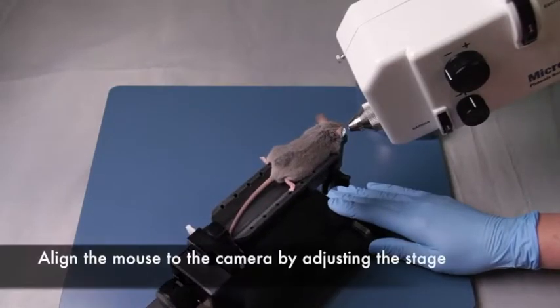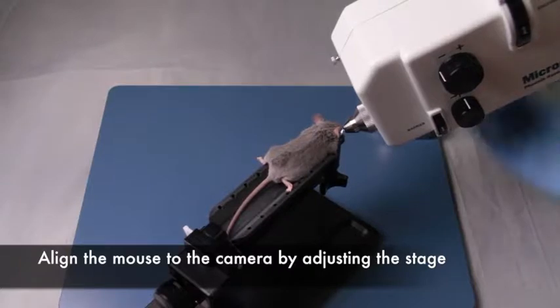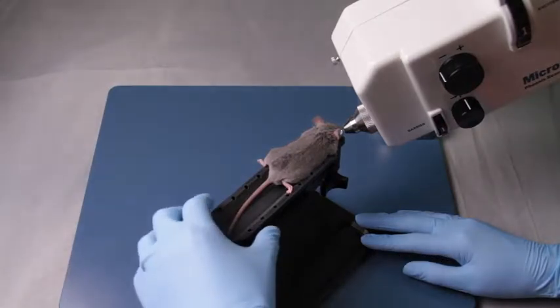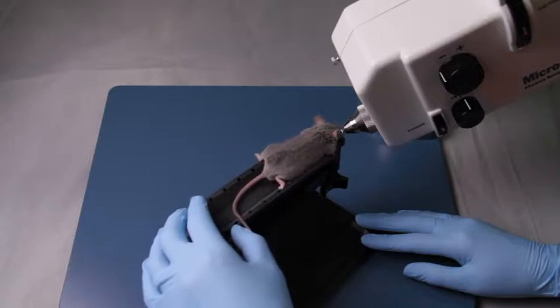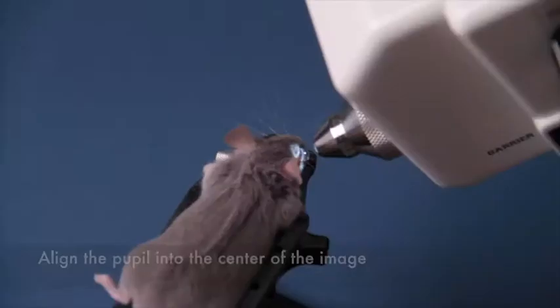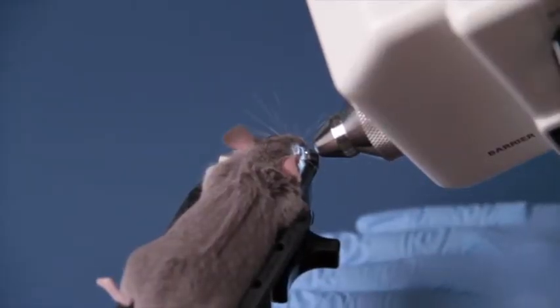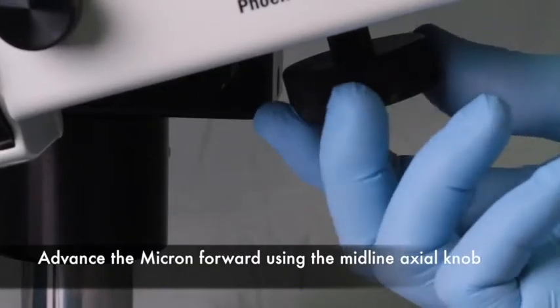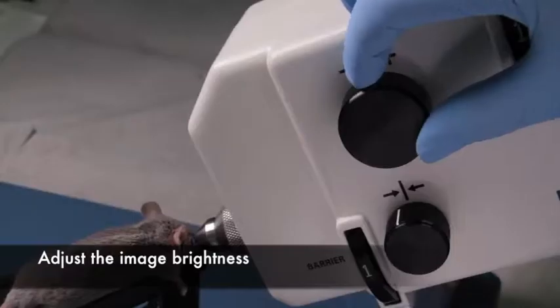Now it's time to position your animal in front of the lens. You can slide the animal stage into place, adjust the vertical up and down, as well as swing it side to side and swivel the animal platform. Maneuver the animal so that the eye or pupil is centered in the image frame. As you bring the camera forward towards the eye using the midline knob under the camera, you can adjust the brightness of the image so that you have an idea of what you're looking at.